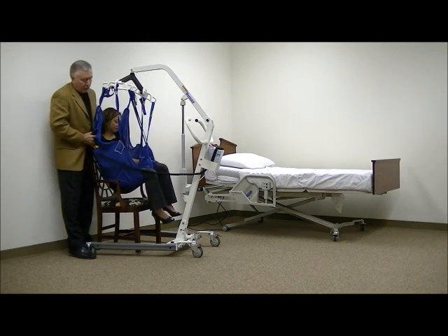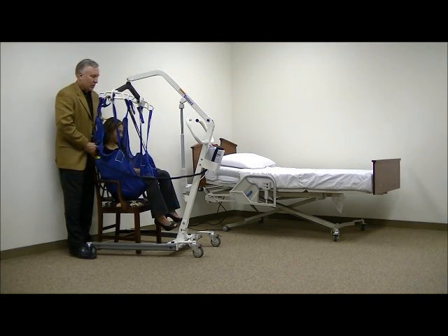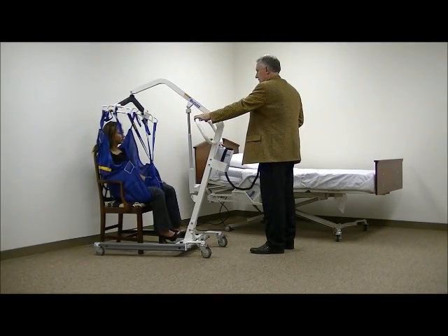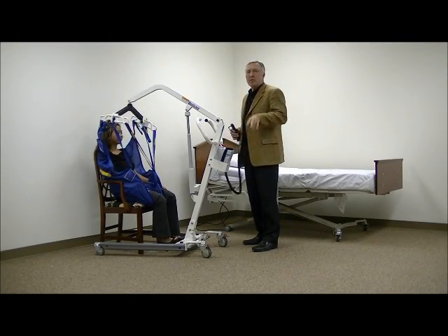You always want to spend a little extra time doing that so you don't have the potential of having to reposition them again once they're down, because that's a lot of work. And that's how we transfer from the bed to the chair. Let's pause for a second.